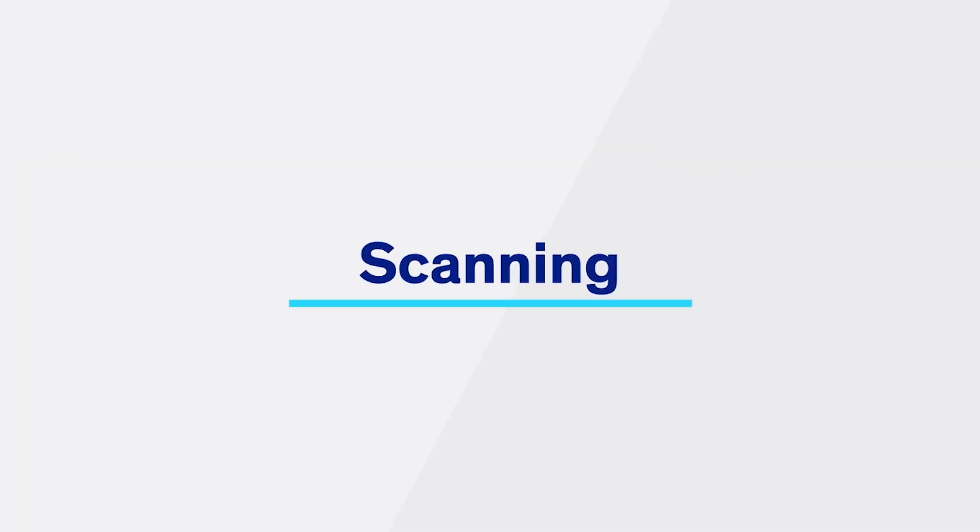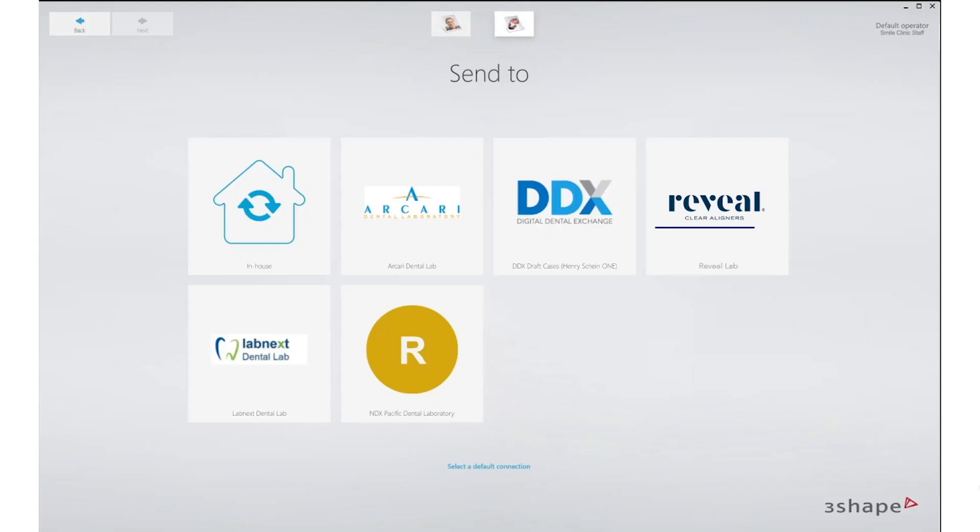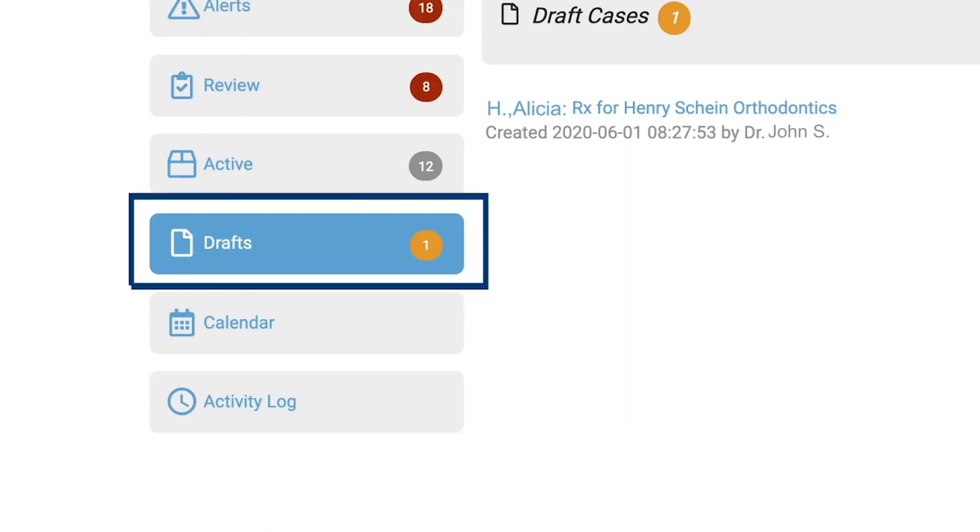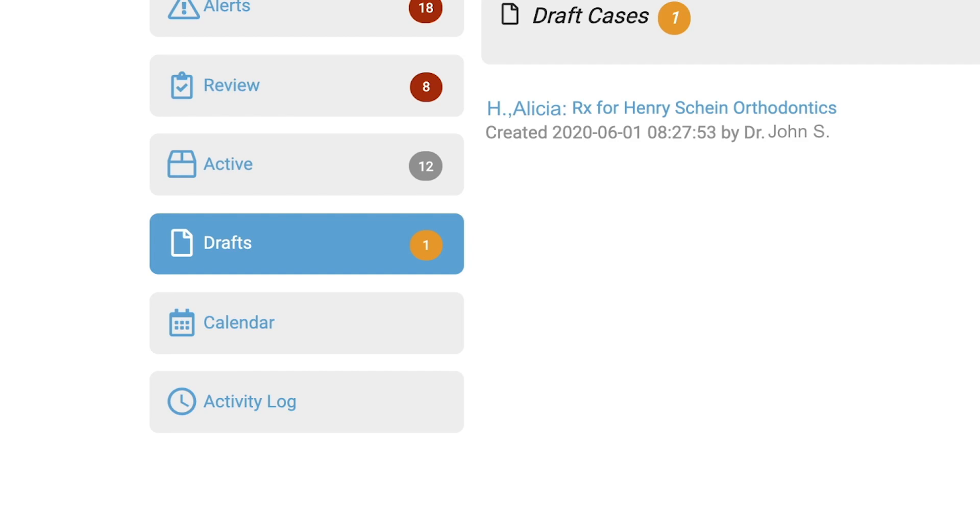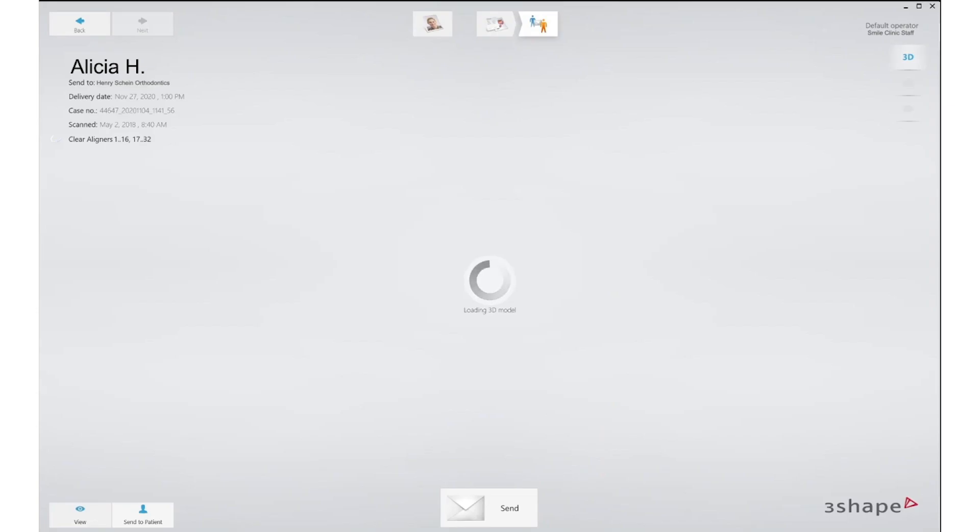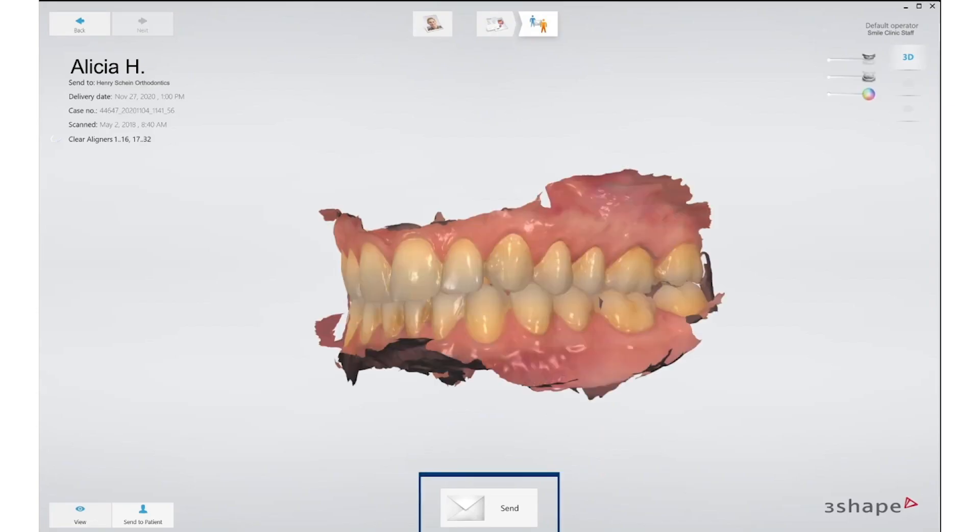When scanning the patient with the TRIOs, select Reveal Lab as a receiver. Enter the patient's details on your TRIO scanner. DDX will now create a draft case and the patient's scans will automatically be stored there. Once the scan has been performed, click Send.